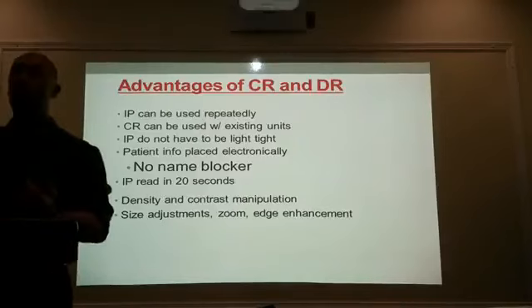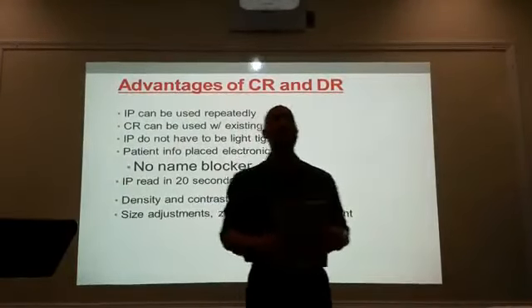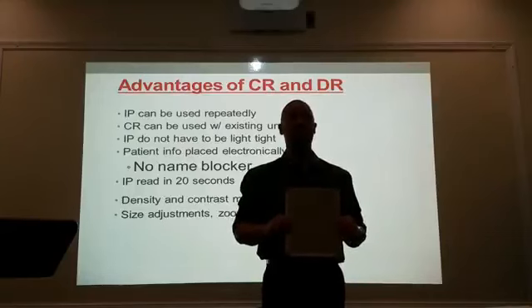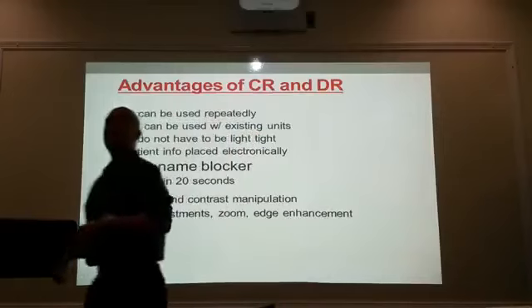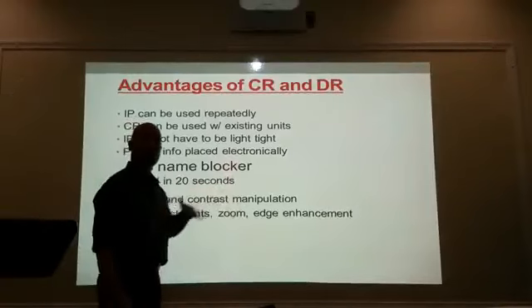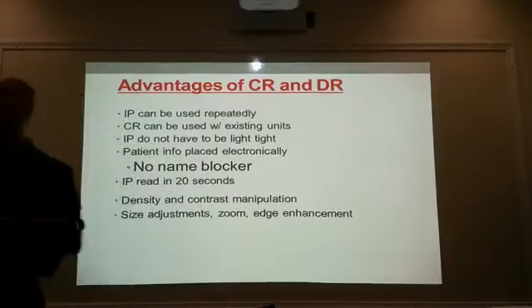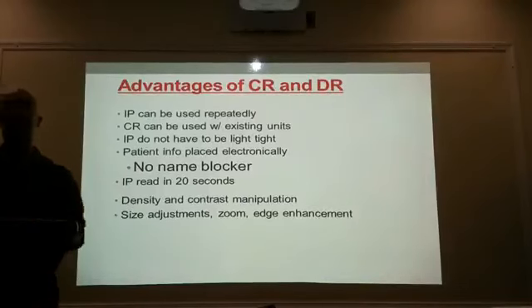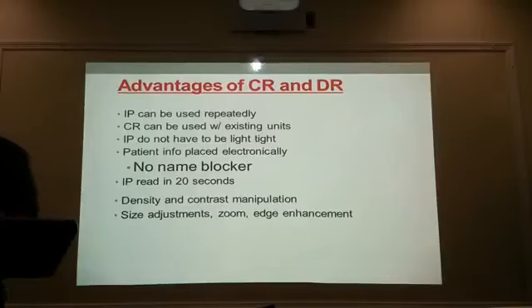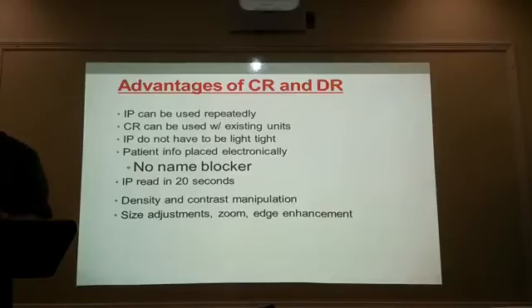So before I continue, with computerized radiography, we're using imaging plates, right? And we still have to process those imaging plates through the reader, right? Direct radiography, there are no cassettes. You take an x-ray, the sensors are in the table or on the chest board where you're taking a chest x-ray, and the signals go straight directly into the software program, and your images come up simultaneously on your screen. Boom, boom, simultaneously. That's direct radiography. Okay? It's a nice thing to have, but it's not as portable, and it does have some limitations.